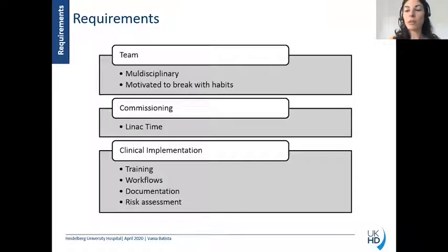Documentation is really important, and also some risk assessment of the new technology that you are implementing in your clinic, because it's a new way of working. You need to make sure that your entire workflow and everyone knows how positioning and treatment using surface guided work.